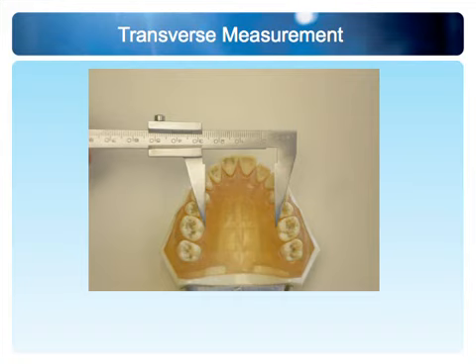So we can see our typodont with an average size of 8.6 or 8.8 millimeter central incisor width, which comes in at a 33 measurement. And 33 millimeters across the palate between those two teeth is a very acceptable arch width. So now, in a perfect world, we're going to measure somewhere between 35 and 39.